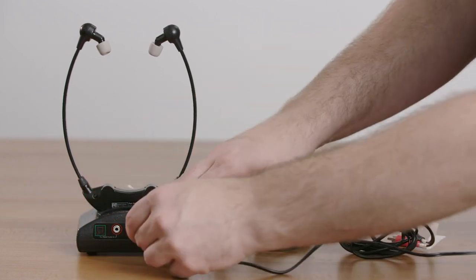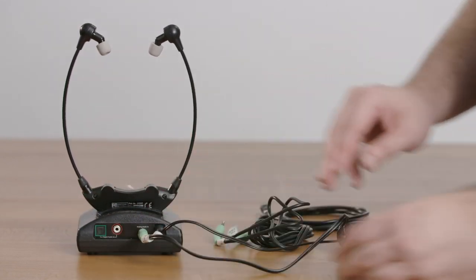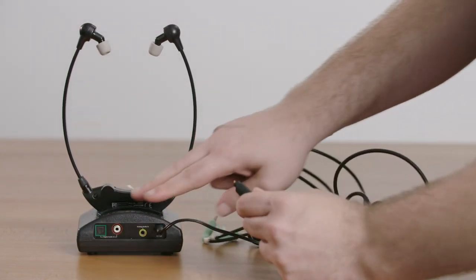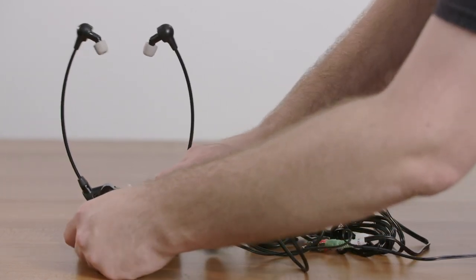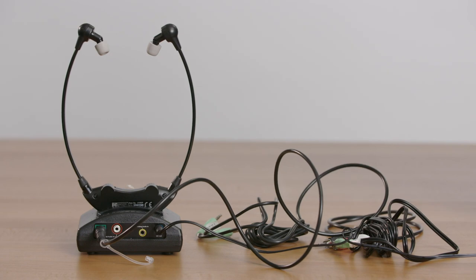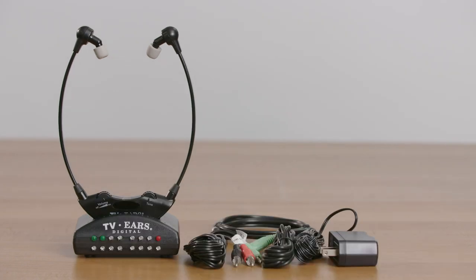If you have a digital audio out — the square-shaped hole with a cover over it — use the optical cord, the one with the caps on it that was at the bottom of the box. There is also another type of connection the TVEARS can use, though the cord did not come with the system. If on the back of your TV you have a round orange digital audio out, that means you need a digital coaxial connection. You can get those cords from any local electronics store.